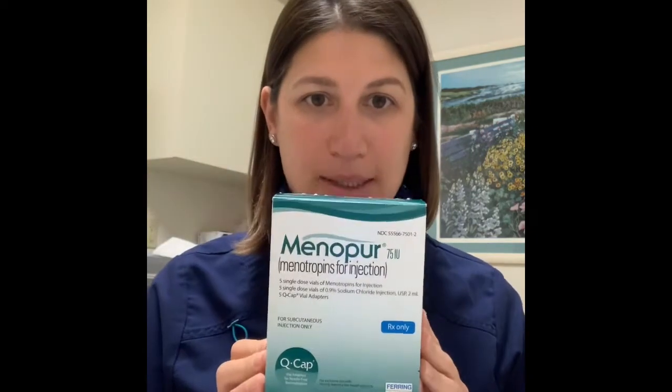Hi guys, this will be your video on how to mix up Menopur. Your Menopur is not a refrigerated medication, so it'll come in a box like this. In this box there will be two boxes inside — one like this and one like this. These are the Q-caps, an apparatus used to help mix the medication. In the actual Menopur box there will be ten vials: five will be the actual medicine and five will be fluid — sodium chloride, water, saline, whatever you want to call it.